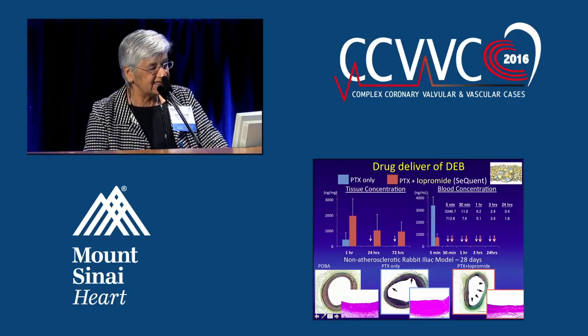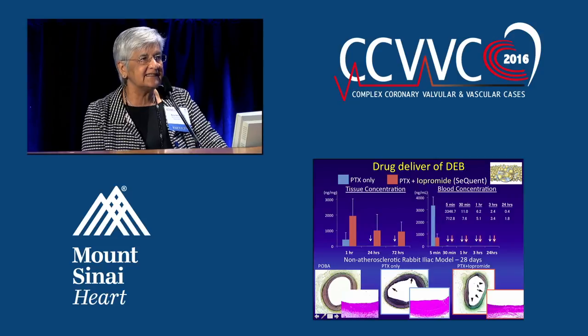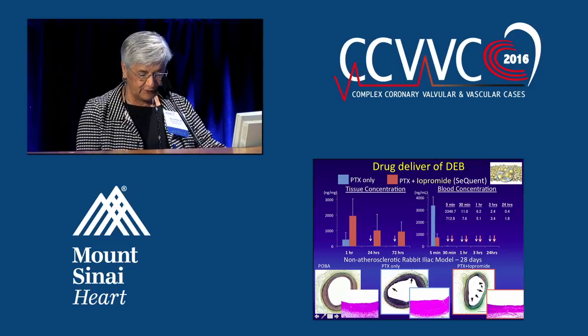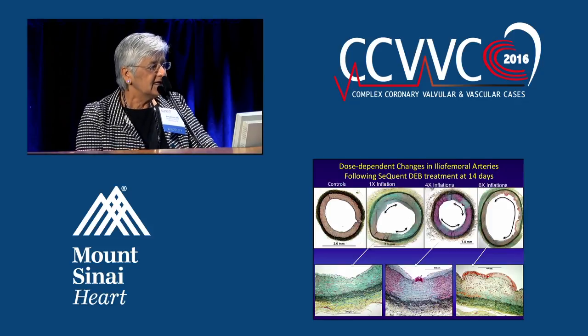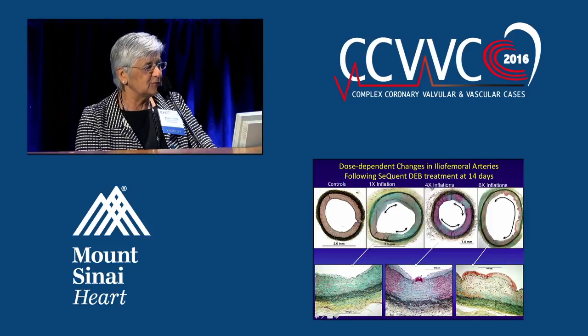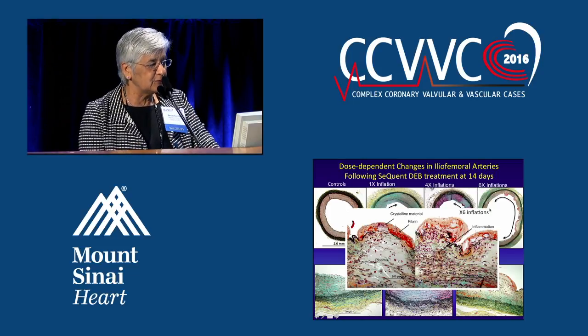If you look at the effects, you can see that the effect is seen only with the iopromide. That is, you have to have an excipient so the drug can be retained. This is just to show you in the arterial wall, if you use 1 balloon, 4 balloons, 6 balloons, you can see very well the drug effects.